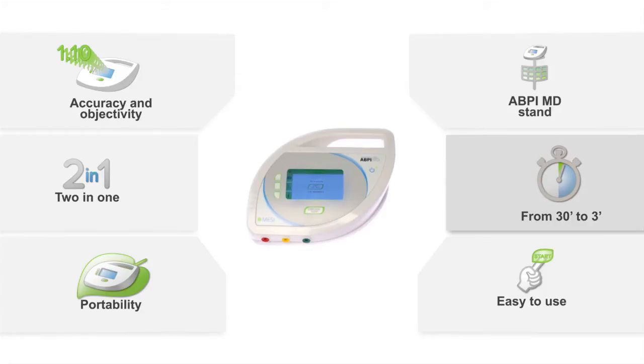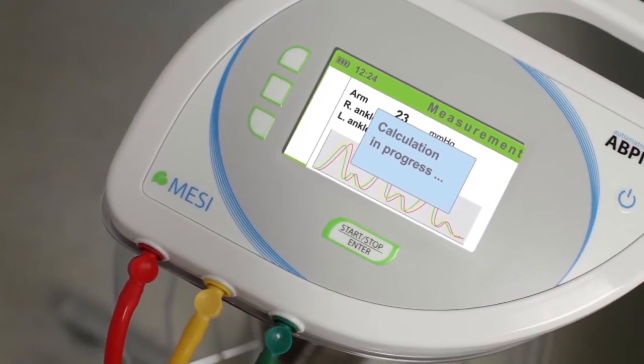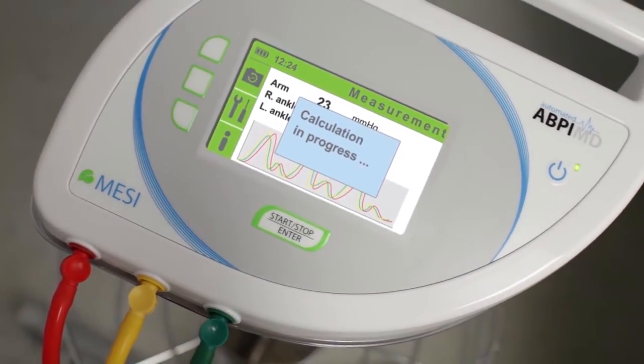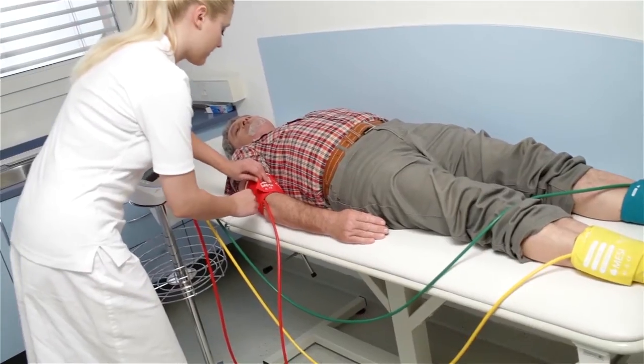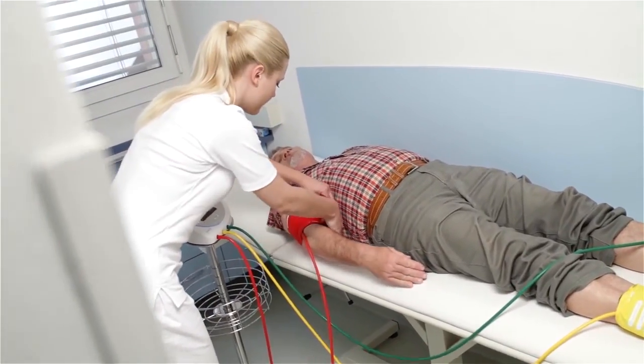While the cuffs are inflating, oscillations are displayed on the device. Fast, simple, and objective measurements offer physicians the opportunity for a reliable diagnosis. Accurate results of blood pressure, pulse, and left and right ankle brachial pressure index are the consequence of simultaneous measurement on the upper and lower extremities.